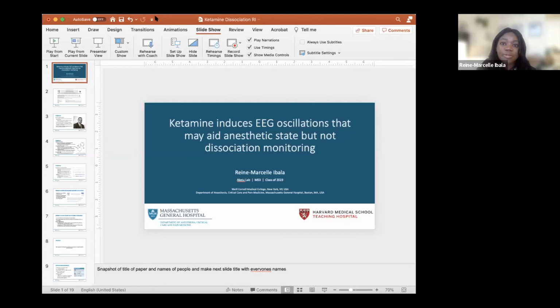I think what's interesting is, as we're moving forward with more diverse patients, whether they can be as useful as they have been in the past. One of the things that we were challenged by was that a lot of EEGs currently used use a lot of glue and gel, and that might not be as helpful when looking at diverse patients. That being said, EEGs are currently used in the OR from an anesthesia standpoint. They're used in sleep studies, and some of them don't need to have these 56, 64 leads. We actually ended up using an EEG more from a polysomnography standpoint, using 6 leads and being able to pull data from there that helped us infer frontal and occipital dynamics. So there are definitely different levels of the technology, and I do think some versions can be streamlined for clinical use. It's now a question of, as we make science more inclusive, how we might adapt this technology to be more representative of patients.